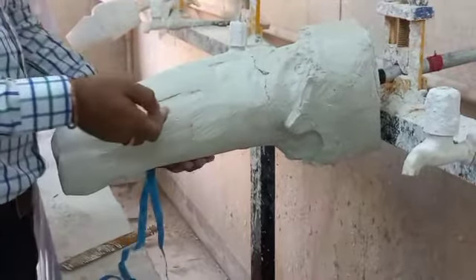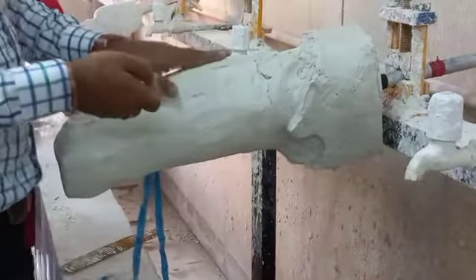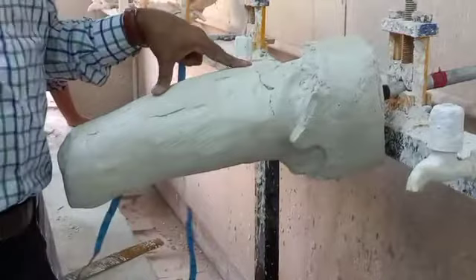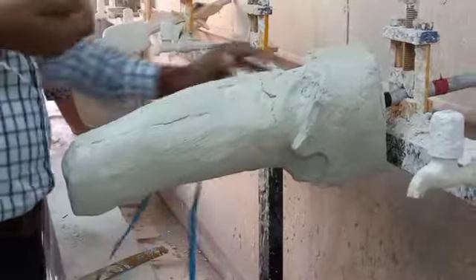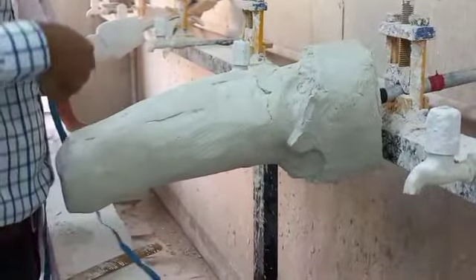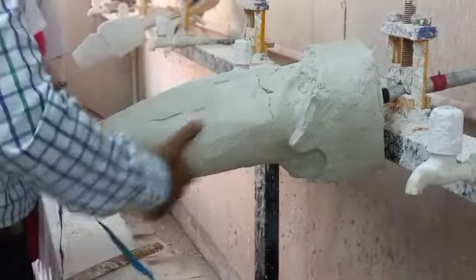Whenever we find that certain areas of soft tissue are very soft and certain areas are very hard over the patient's limb, we understand we can reduce more material from the posterior side. Let's say the posterior soft tissue is a little softer compared to the anterior, because anteriorly there is less tissue. So if you reduce a little more in the posterior, maybe there will be reshaping.